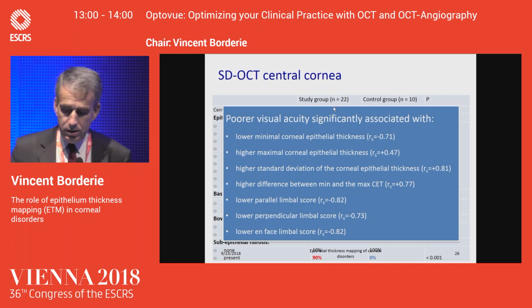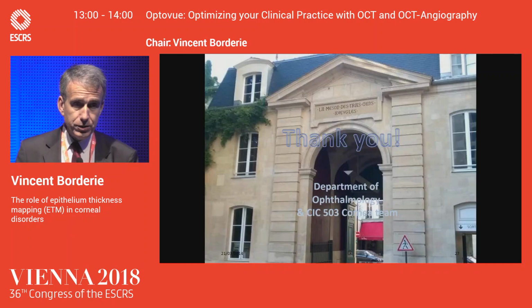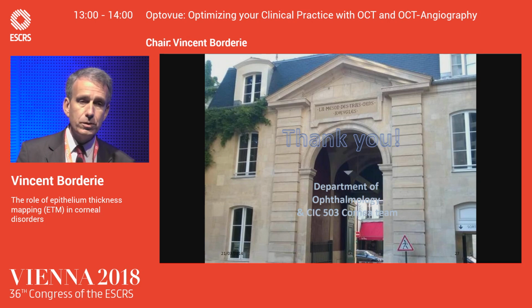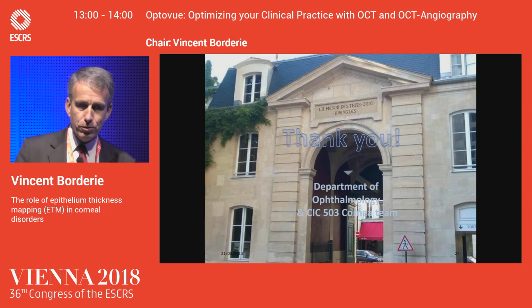So OCT is really useful for diagnosis, evaluation, and follow-up of many corneal disorders. And I must say that currently, we always assess corneal patients with OCT, and often we first look at OCT images before we look at the slit lamp.